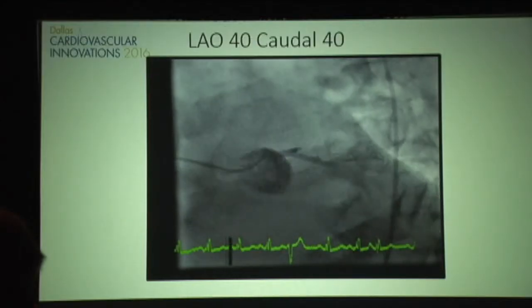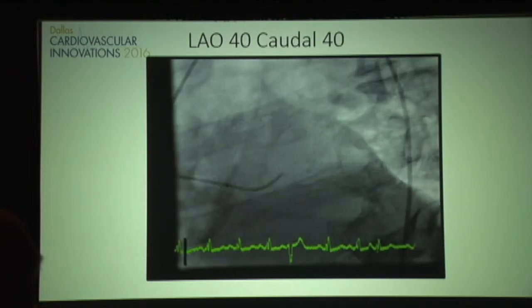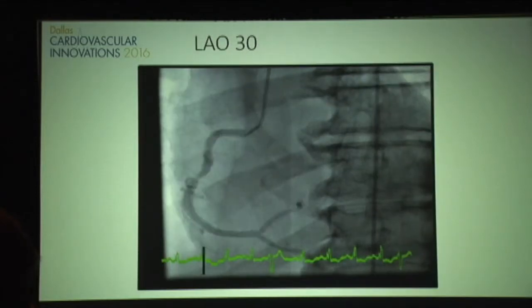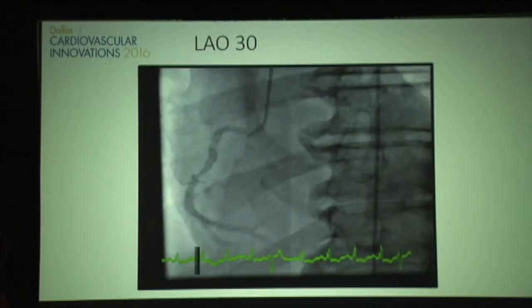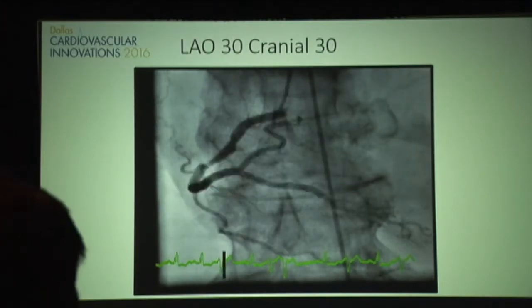So, of course, we suspected that he probably would have multivessel coronary disease. He was taken to our cath lab, and you can kind of hear the collective groan in the control room when we took our first shot. It looks like he's got both an occluded LAD as well as an occluded circumflex. His right coronary artery has an intermediate mid-stenosis and well collateralizes both of the left coronary vessels. Here's another view of that, showing the LAD.